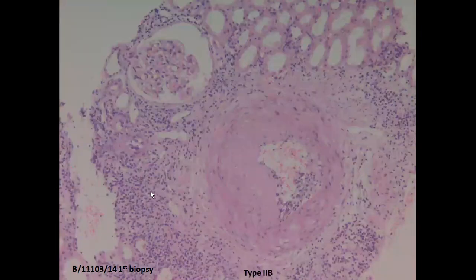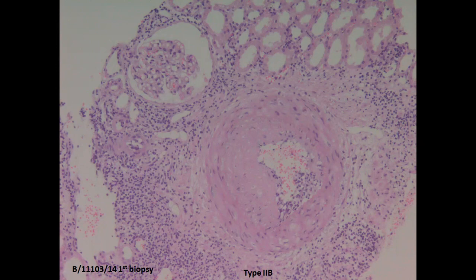So just see, looking at this biopsy, if you see blue cells in the kidney biopsy, that suggests interstitial inflammation. So in this, you hardly see very minimal blue cells. This is a vessel, a large vessel, and you don't see significant blue cells. So the blue cells are there, but this is a vein. So around the vein, you normally get some lymphocytic infiltration. Whenever we try to quantify the amount of interstitial inflammation, we always ignore the infiltrate which is seen in the perivenular areas or around the vessels. So if we ignore this infiltrate, then we hardly have a minimal infiltrate which is seen here.